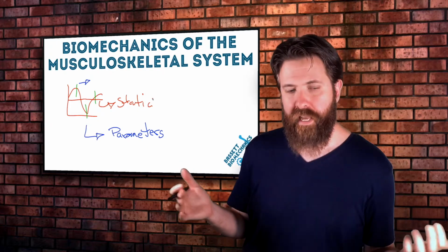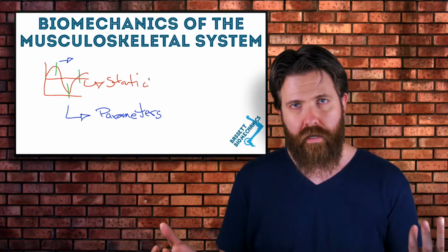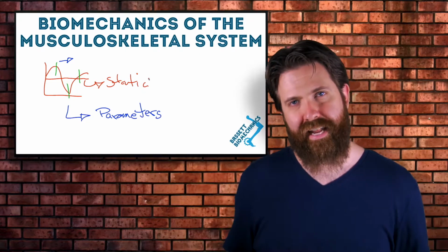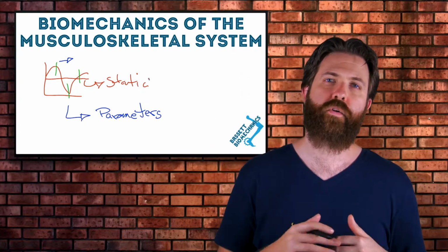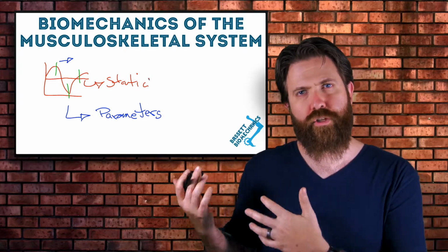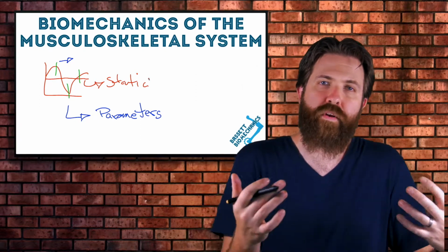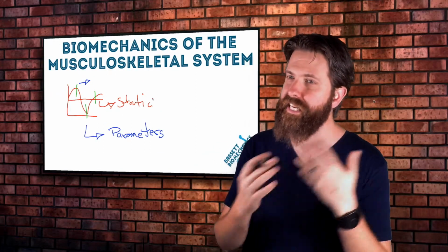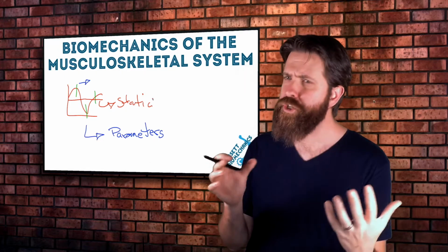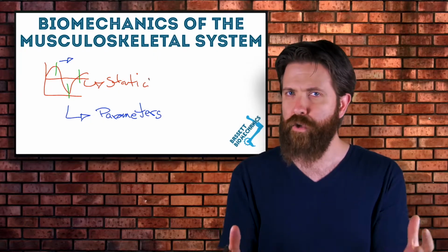So if in a static trial, a child has an equine position, that will affect your understanding of the dynamic results. So that equine ankle angle will tell you something about the results you're seeing in the dynamic trial, which may not be inherently obvious without that static information. And we're also going to talk about things like segment length and width, things like that, which can be very helpful for a clinical evaluation as well.